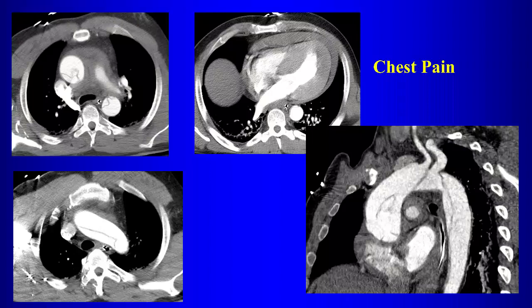Well, you only have two choices there, so. Right. Yeah, it's the right coronary artery. The flap tends, for whatever reason, to spiral down closer to the right coronary artery. So usually the coronary artery involved is the right coronary artery. So those are two complications. One, hemopericardium. Two, involvement of the right coronary artery. The third complication that can lead to instant death is tamponade. Well, that's from the hemopericardium, right? So that, we already covered.